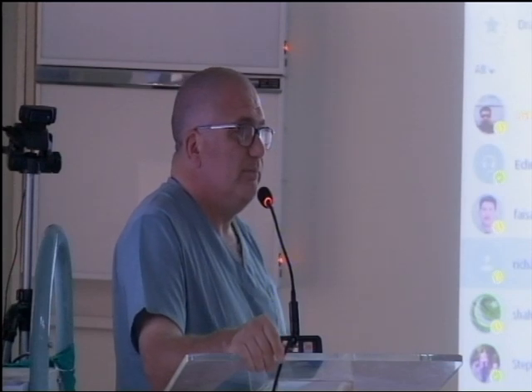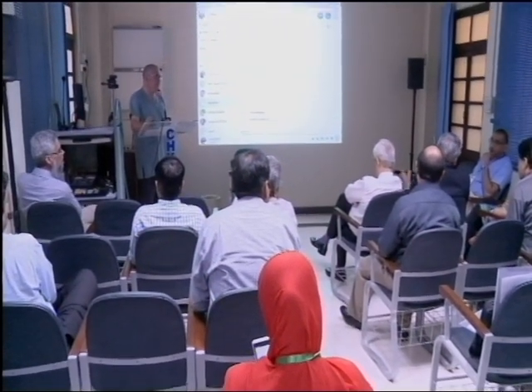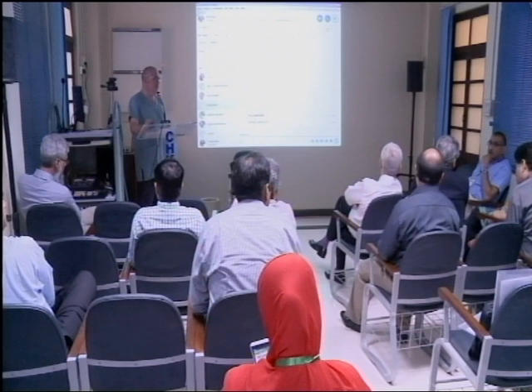So when I've got a high-risk polyp, I always double book, as it were. The point here is that if you give the patient an option of multiple colonoscopies, and if you had one, then you had a good experience. And personally, I would rather have my endoscopy done than have my colectomy. So why would I subject myself to surgery when I can have something done in competent hands by endoscopy? And there the cost is not so much of an issue. The question is, do I want to be cut and do I want my colon removed when there is a possibility that I may get away with it? And if you give that option to most patients, the patients will make that decision.